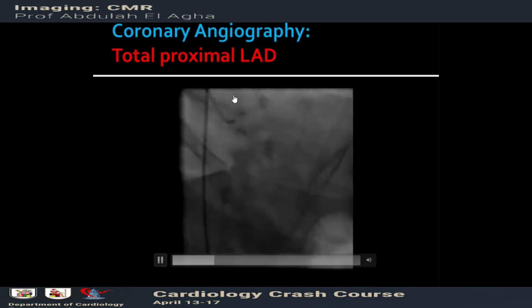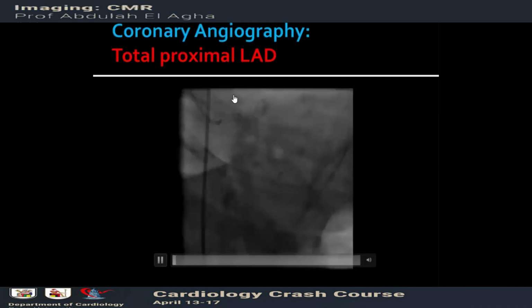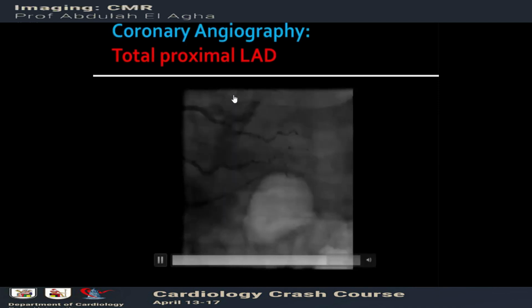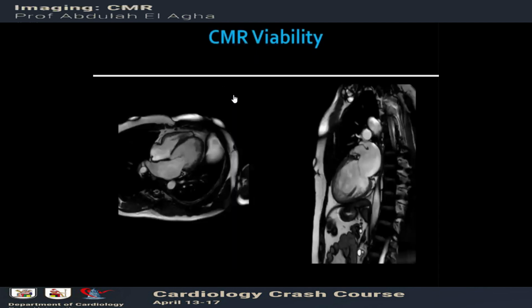Since it's akinetic with total LAD occlusion, it's not an acute situation. It's a missed anterior, not a primary PCI. So this patient was sent for CMR viability. So this is one of the major indications of cardiac MRI.